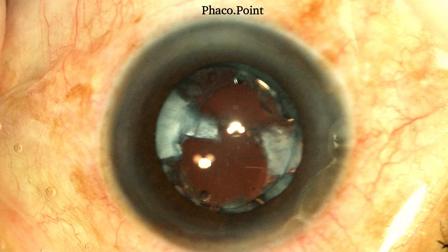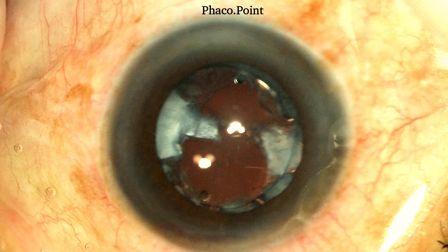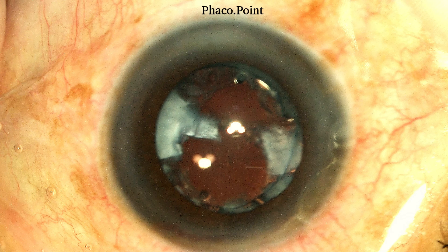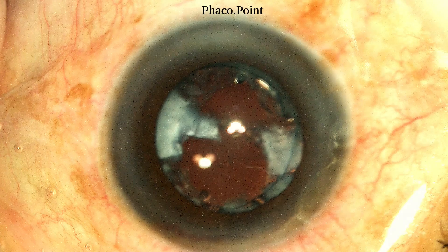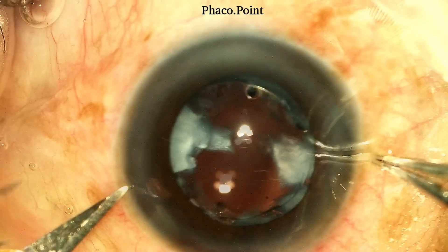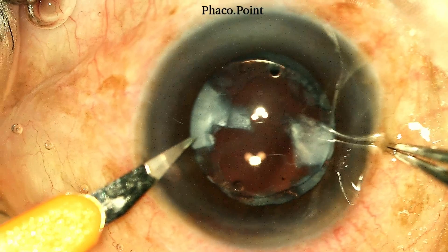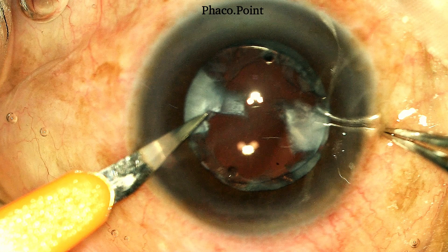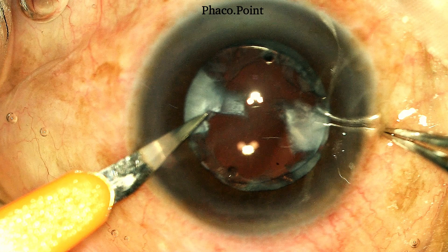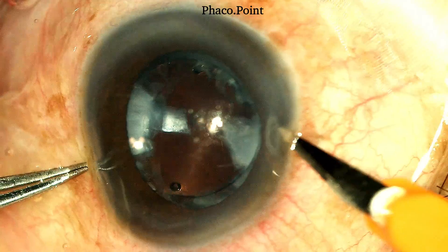We decided to take the patient up for surgical removal of the residual cortex. Since this case was primarily managed by another surgeon, I always choose to make incisions at a location and of a size that enhances my ergonomic ease intraoperatively.